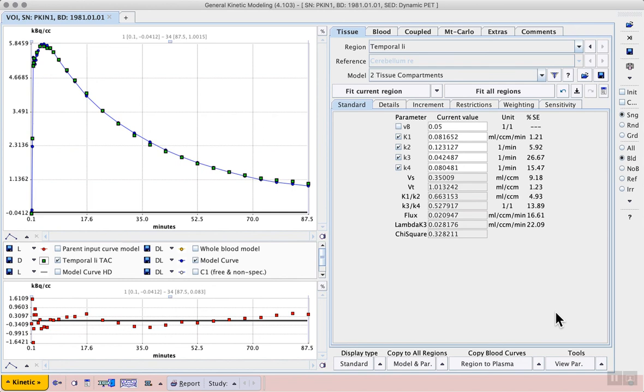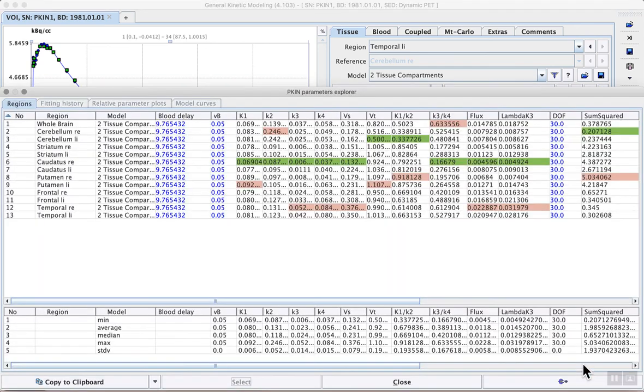And when you want to have a tabulated overview of all of the results we can use the view parameters tool in the lower right.